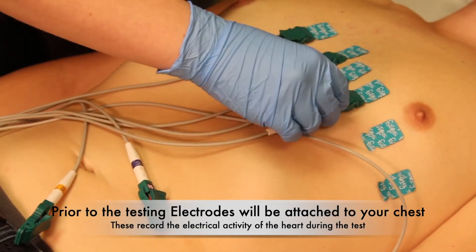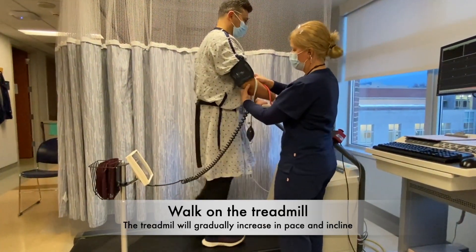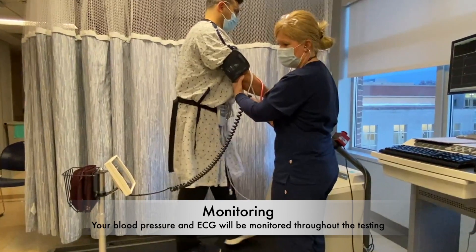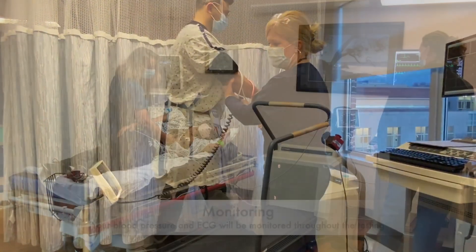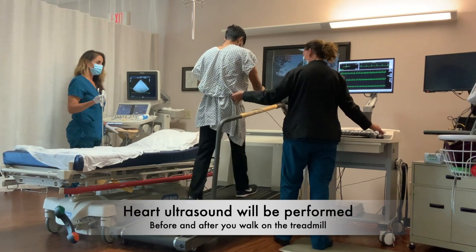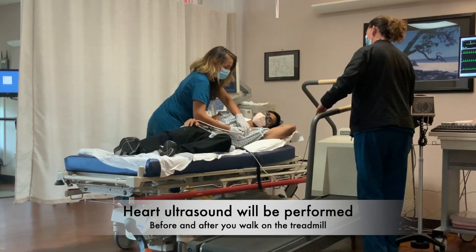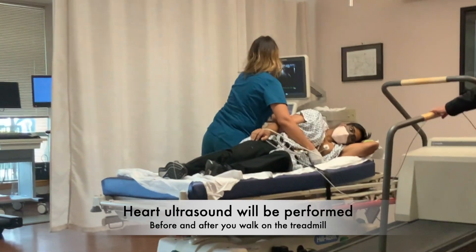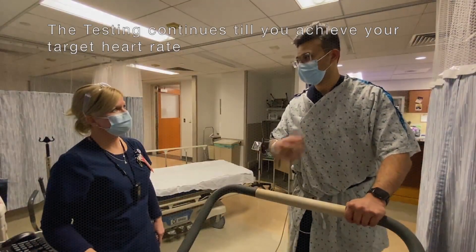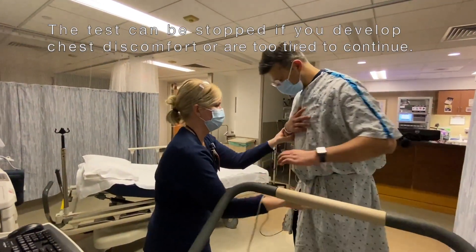During the test, you will have electrodes attached to your chest. You will walk in place on a treadmill with increasing speed and incline. You will get an ultrasound of your heart before the test and after you have walked on the treadmill. The test stops when you reach your target heart rate or develop chest pain, an irregular rhythm, or become too tired and need to stop.